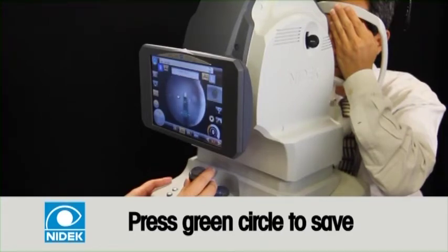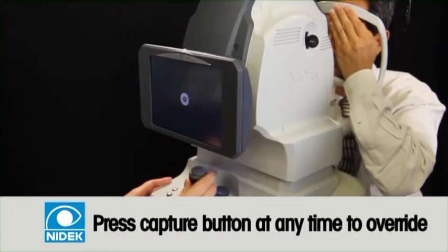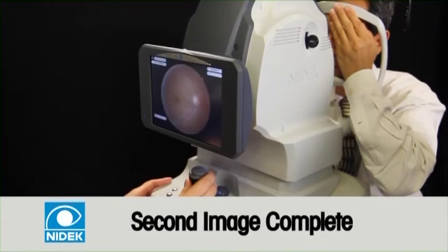Place the pupil markers over the white reflected dots and slowly push instrument towards the patient. At this point, your alignment markers will appear. Again, green meaning get closer, and purple meaning pull back.